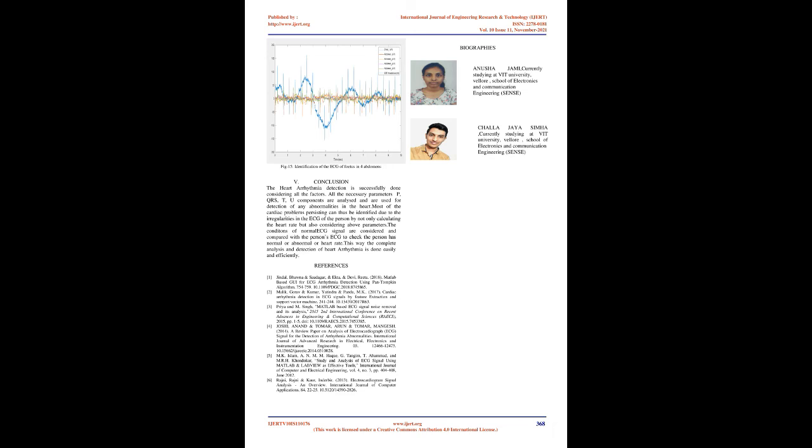Detection of QRS peaks of 100m.mat. Sampling frequency equals length of value divided by time, where value is the sample of a signal at a particular time instant. Then the baseline wander noise and power line noise of the data sample are removed as described in the above section. Detrending of the noise-removed data sample: linear trends are removed from the data sample. Detrended data sample equals the noise-removed data sample signal without trends. The signal is now smoothened using the Savitzky-Golay filter.